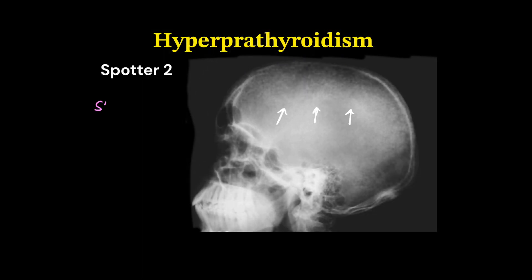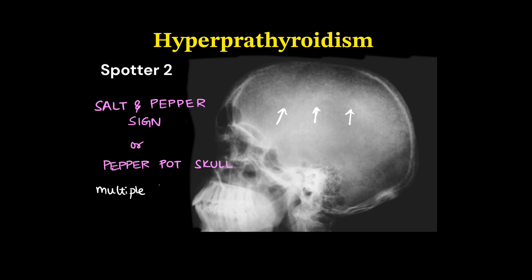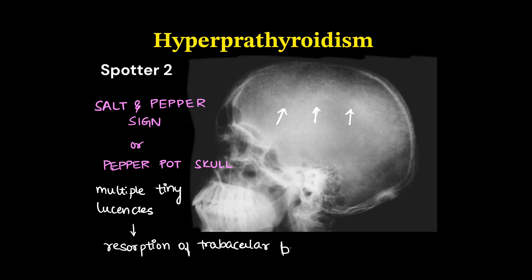This is a lateral skull X-ray showing a case of hyperparathyroidism. It shows the salt and pepper sign, also called pepper pot skull — that is, multiple variable-size tiny lucencies or lytic lesions throughout the skull. This is because of resorption of trabecular bone.